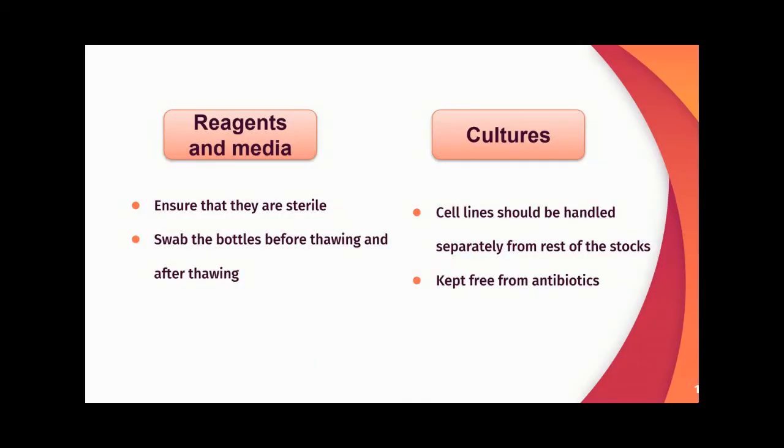For reagents and media, we should ensure they are sterile. Bottles should be cleaned with 70% IPA before and after use. For cultures, cell lines should be handled separately from the rest of the stocks. Two cell lines should not be mixed, and cell lines should be kept free from antibiotics.